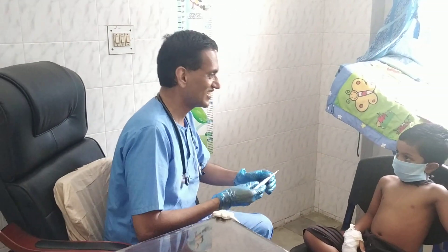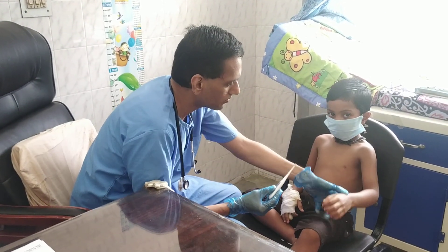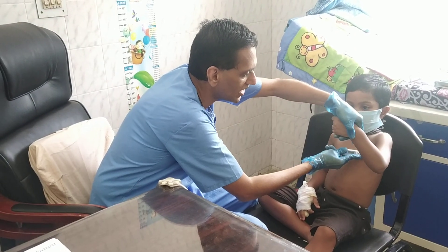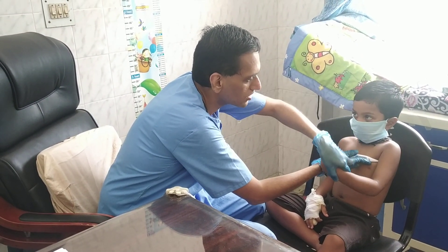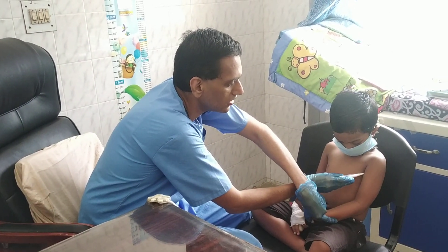I'm going to show you a live demo using a child here. I'm going to record his temperature and see what happens. We're going to keep this metallic tip underneath the child's arm, then switch this on and keep it underneath the child's skin.